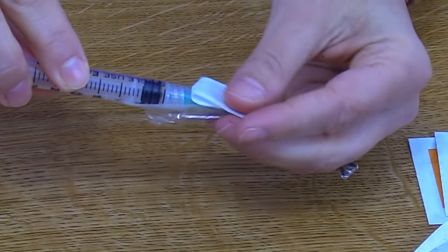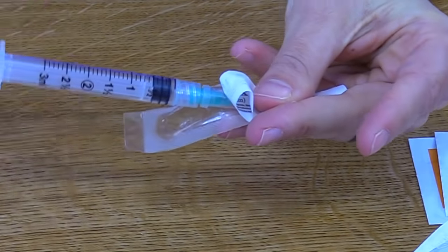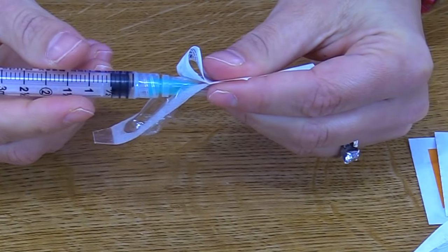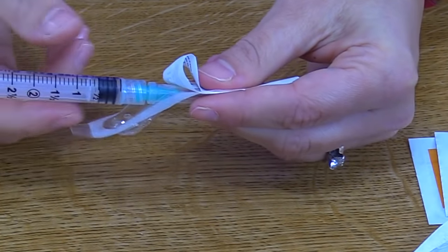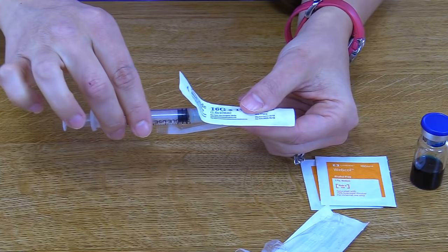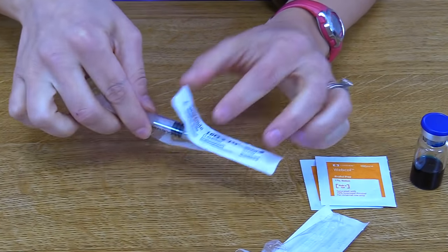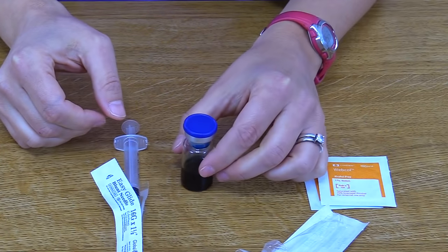This is very important — you want to twist the needle on and make sure it's on there very securely. If not, while you're withdrawing or administering the medication, it can easily become loose and you'll have to start all over. After you've done that, keep it in its packaging with its cap on and set it aside while you prep your vial.